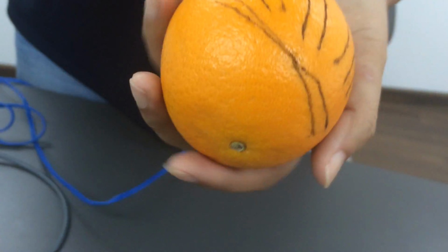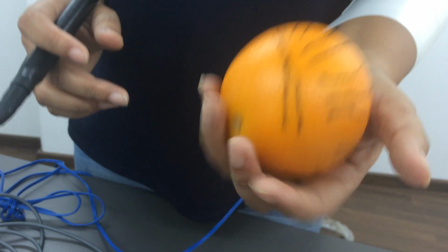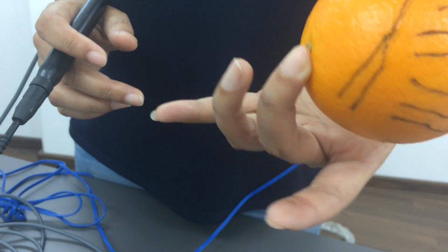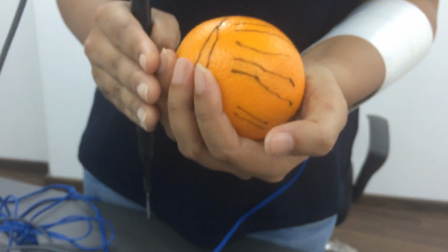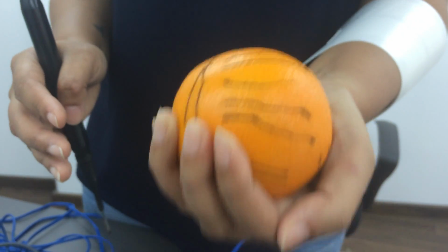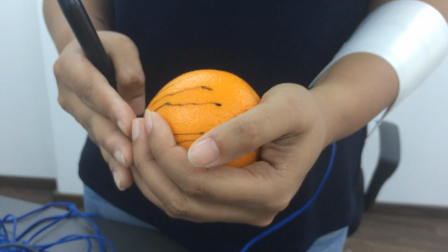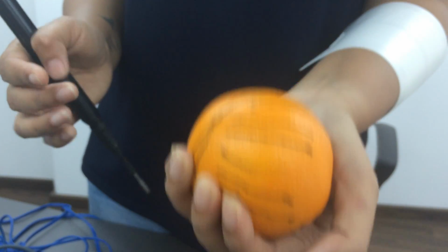One thing to keep in mind is whenever you are using anything in your own hand, try not to hold it like this. Try and hold it completely so that your current concentration is not high at the edges where you're holding. It's always best to have a lower current concentration with larger surface area, so it is advisable to hold the orange like this.